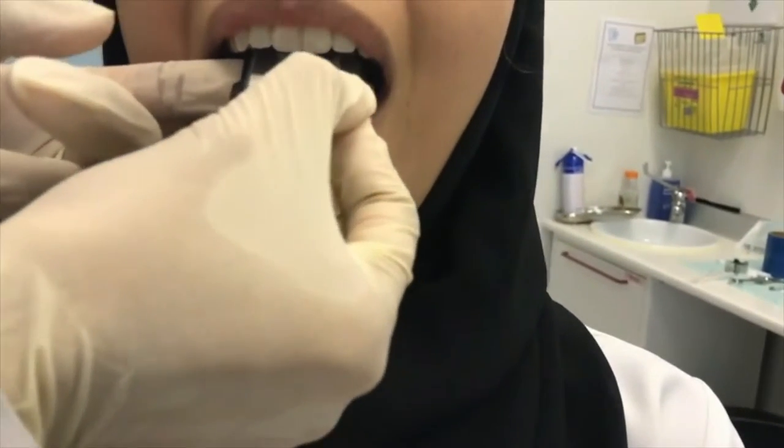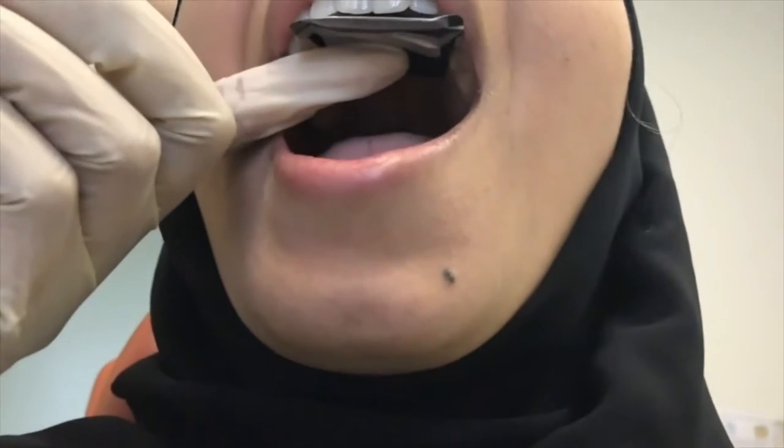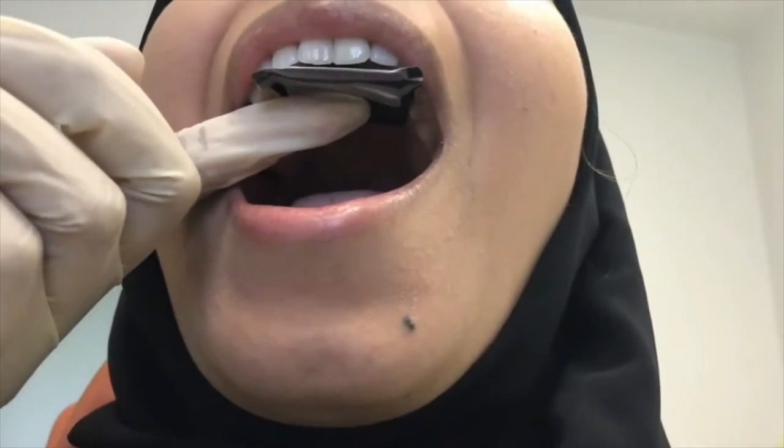For anterior teeth, the film should be positioned vertically. The patient is then asked to gently support the film using the thumb.